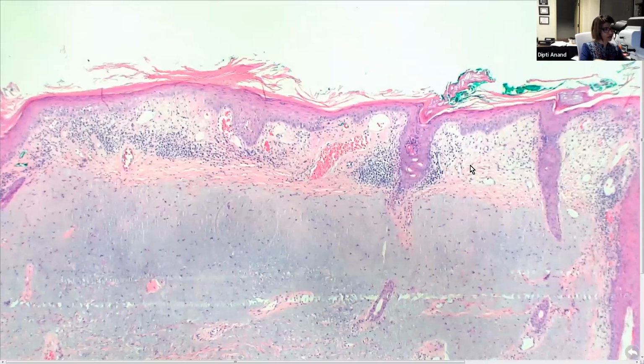But what they are trying to say here, for example, like in pilomatricoma, you can see sometimes you can just leave behind the calcification and you do not see the shadow cells. But honestly, subepithelial calcified nodule always looks like that. Like instantly when you see it, you know it. And you can predict the clinical. So it is something very specific, but I don't know.